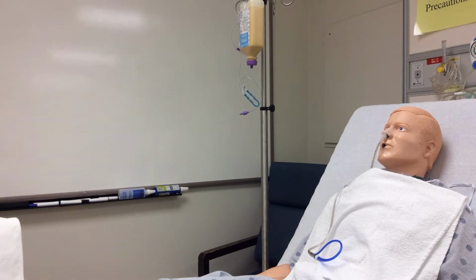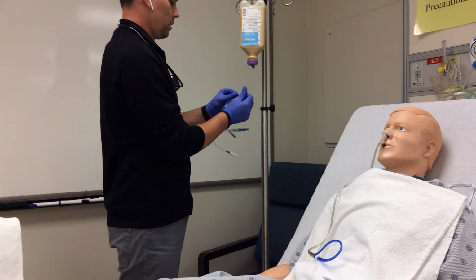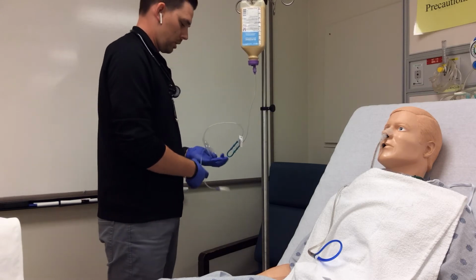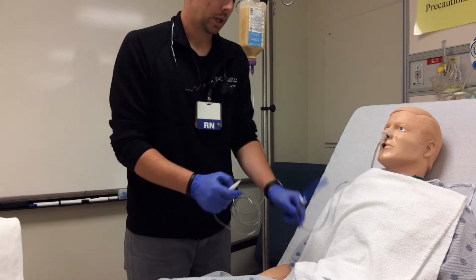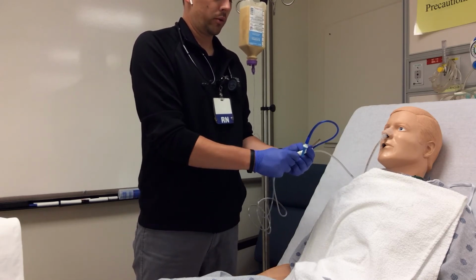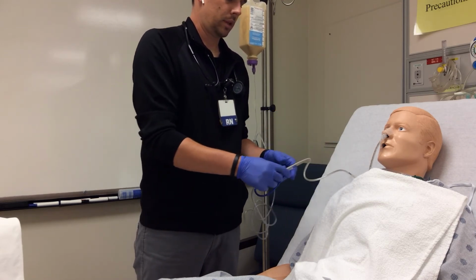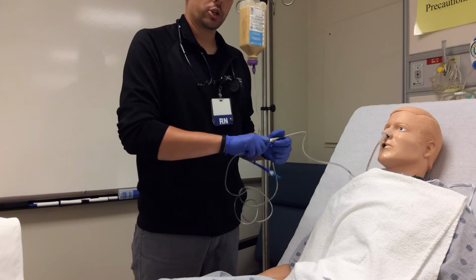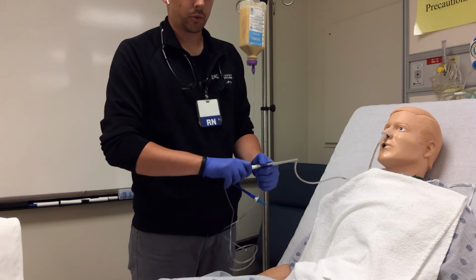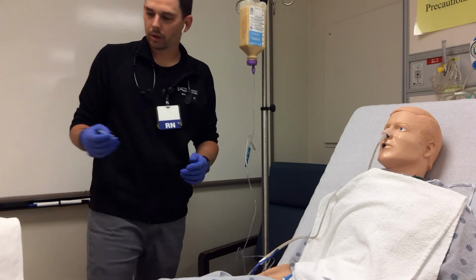Okay, so once we have it primed, we have everything labeled, we are going to take our purple end, clamp our NG tube, remove our blue port, remove our protective cap from our tubing, and connect it to the NG tube itself. You want to make sure you have a good connection here because you don't want it to be leaking on the patient or becoming dislodged. So we want to make sure it's in there nice and snug so that when it's infusing, we know it's going to be going through the tube.